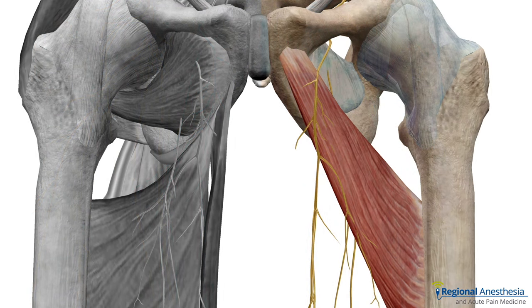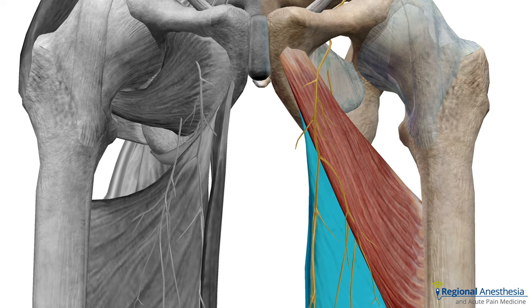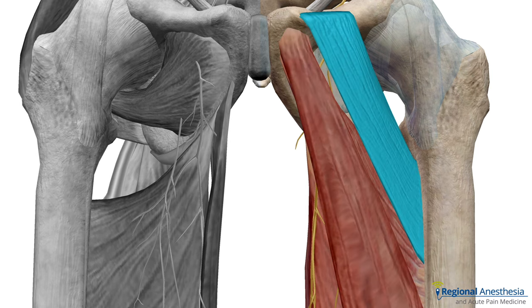The adductor brevis muscle acts as a splitter. The anterior branch of the obturator travels anteriorly to it, and the posterior branch goes posteriorly. Deep to brevis is the adductor magnus — the posterior branch is sandwiched in the plane between brevis and magnus. Superficial to brevis is the adductor longus, and the anterior branch is sandwiched between these two muscles. Pectineus muscle sits out laterally.